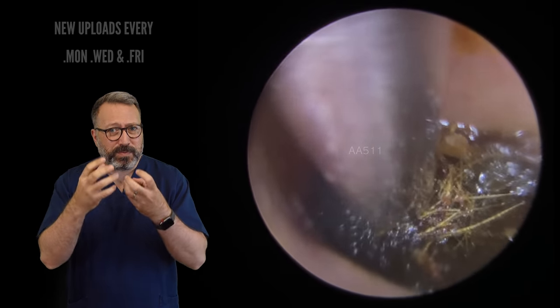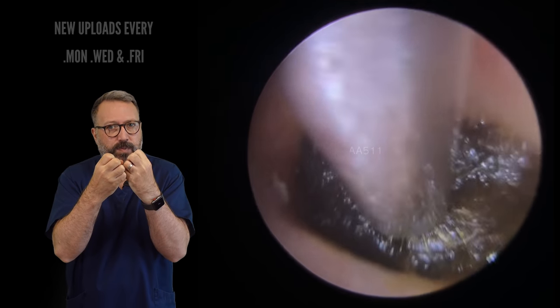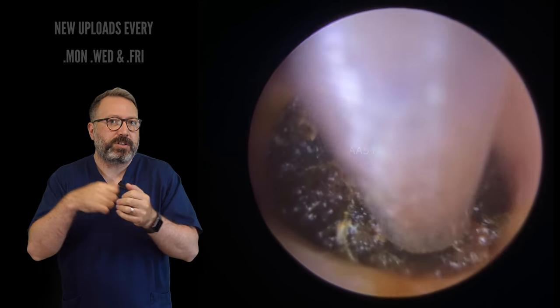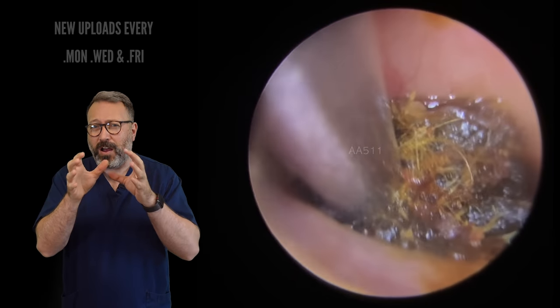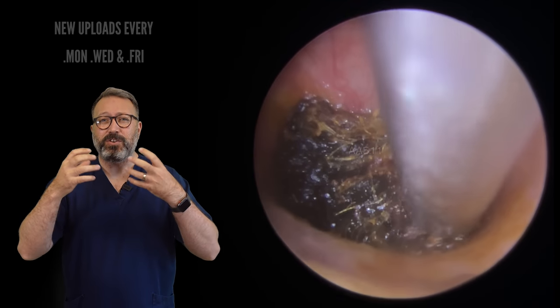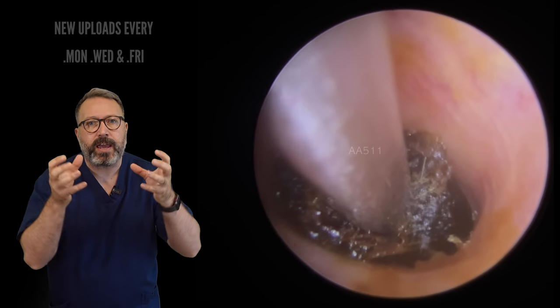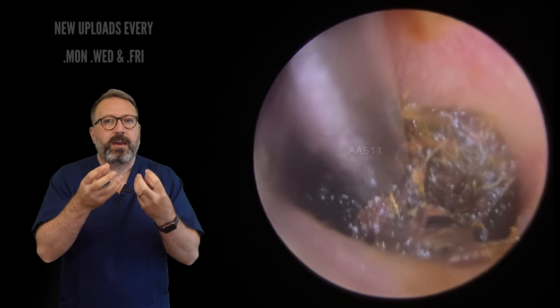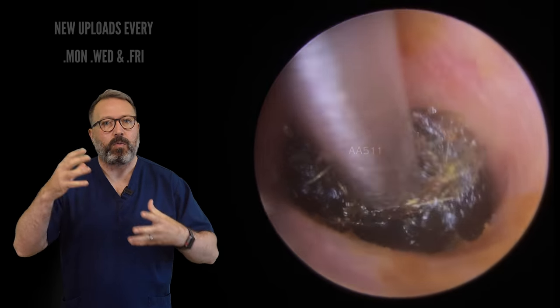When it oxidizes, it becomes much, much darker. The difficulty with this wax — you can see we've got these little tiny fibers and hairs trapped in here as well, which is binding this wax together. The other thing is it's perfectly formed. Because it's been repeatedly pushed into the ear out of sheer desperation, it's formed to the shape of the ear canal just in front of the eardrum. So this is always a really, really tough place to take wax from. Because it's hardened up that much, it becomes increasingly difficult because you can't really maneuver or loosen this. It tends to become really sticky and dry onto the opposing canal walls, so you end up with a plug that's very, very thick — like a very solid clay-type consistency, anchored onto the canal walls all the way around.